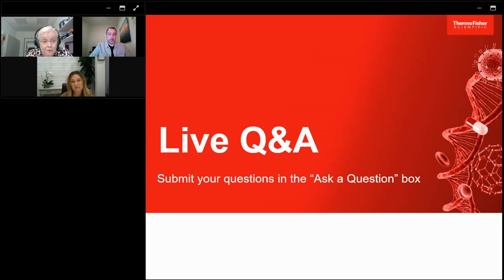Okay, unfortunately, that's not a problem of the APAS system, it's really a problem of our own LIS. We have no connection of the results directly to the LIS. So at the moment, our technician has to enter the negative result by hand.